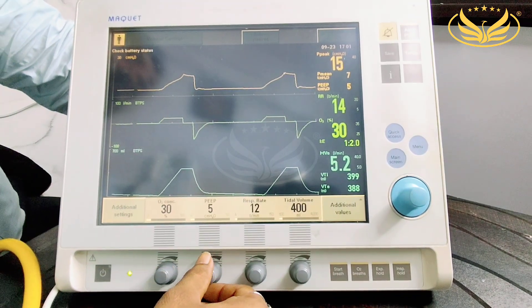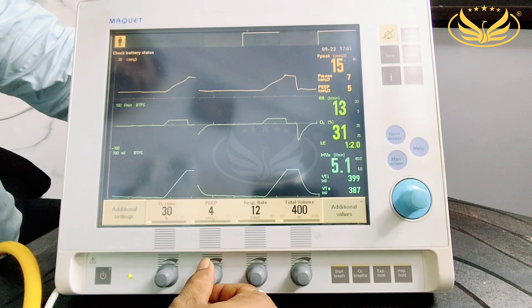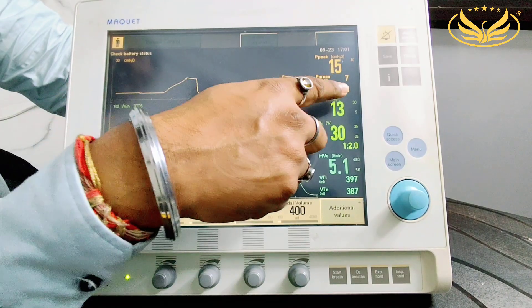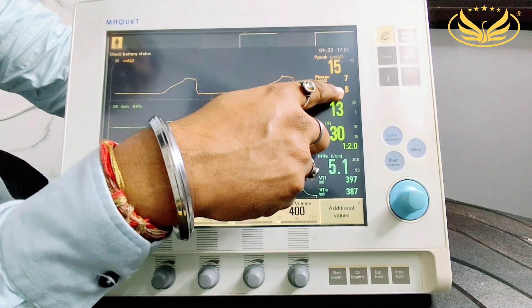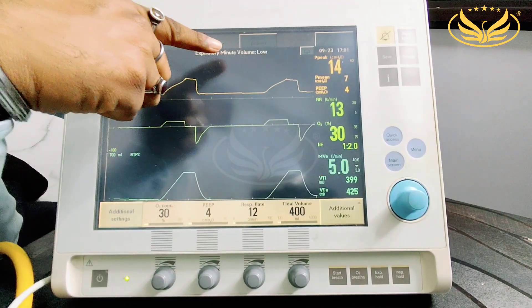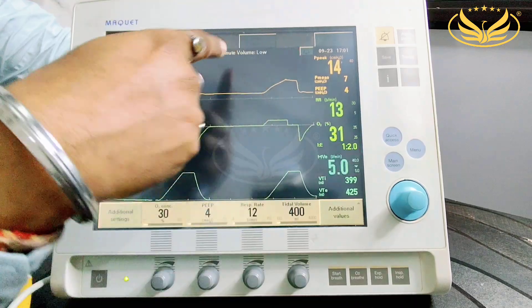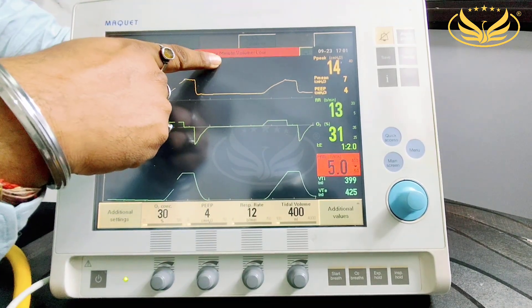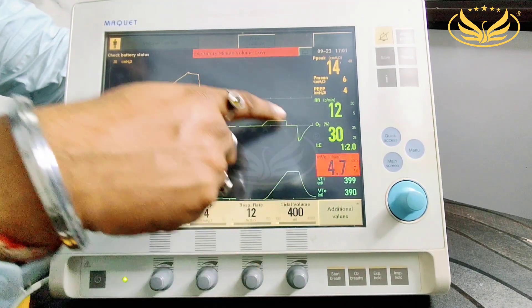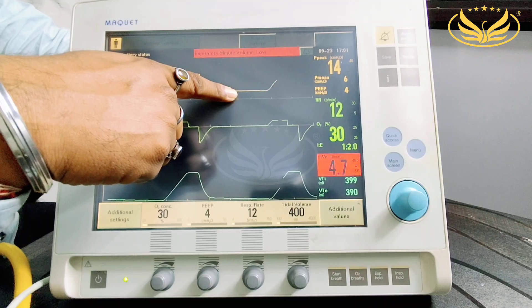If I want to change PEEP from 5 to 4, the moment I change it, 5 will become 4. You can see now it is showing that the minute ventilation is low as compared to the parameter which we have set in the alarm.